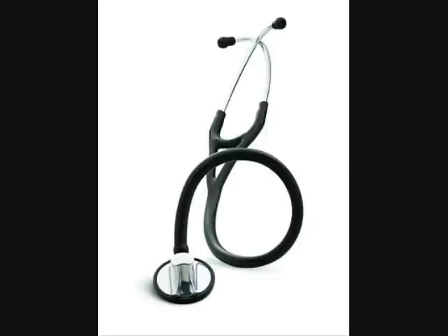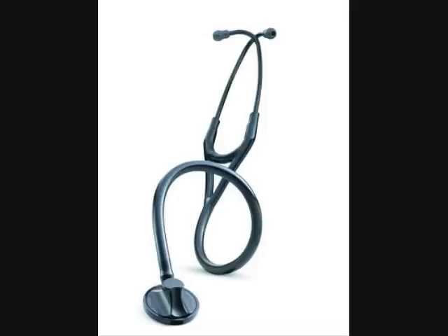Welcome to DrStetoscope.com. You're looking at the 3M Littmann Master Cardiology Stetoscope. It comes in a variety of colors. A tunable diaphragm and superb craftsmanship offer the ultimate performance in a single-sided stetoscope.